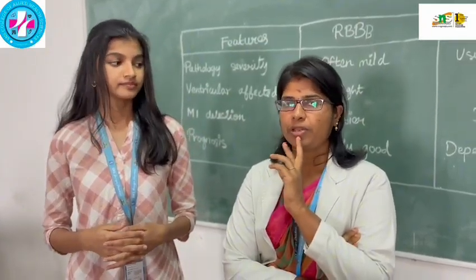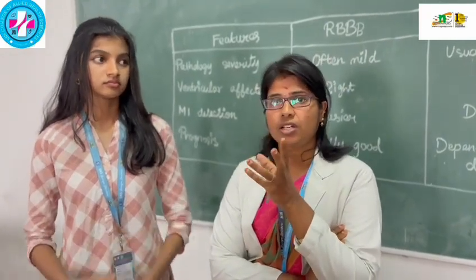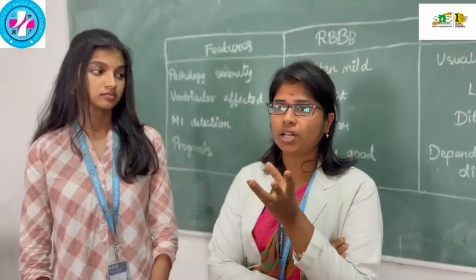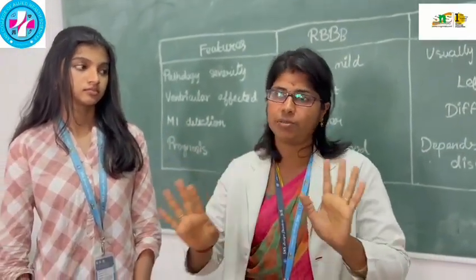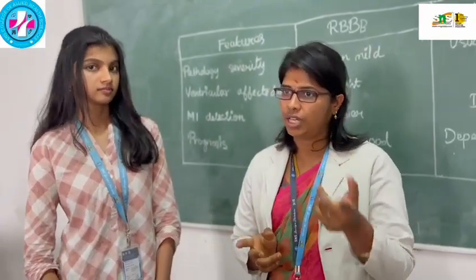Sometimes it may be due to post CABG surgical issues also. If there is a skipped beat or trigeminy, it can also be combined with LBBB. So post surgery is also one of the most common causes for LBBB.